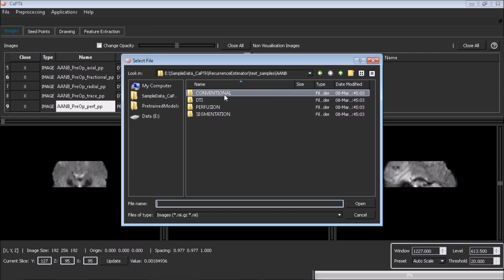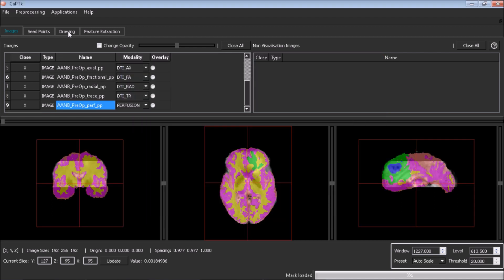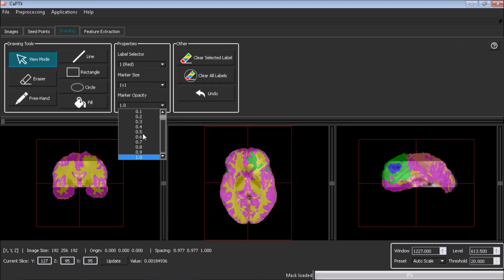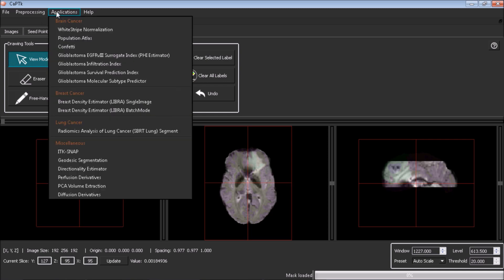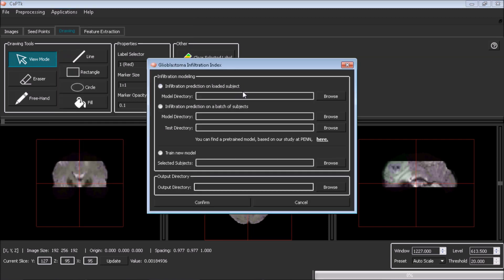Load the segmentation. Launch the application using the option Glioblastoma Infiltration Index underneath the Applications menu.